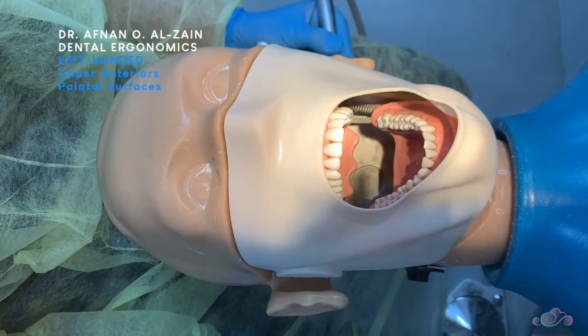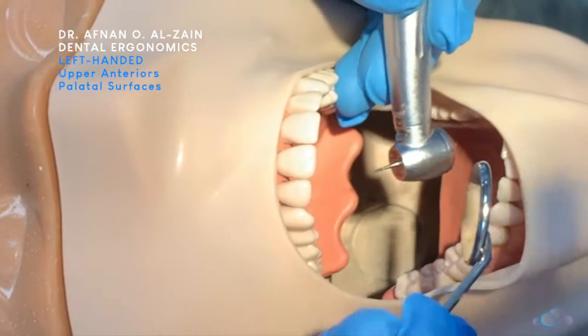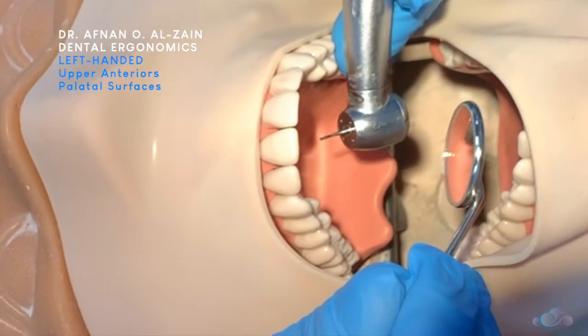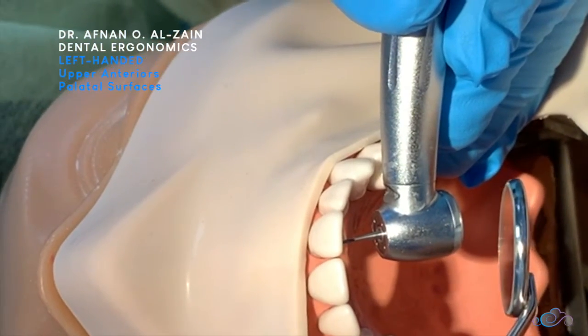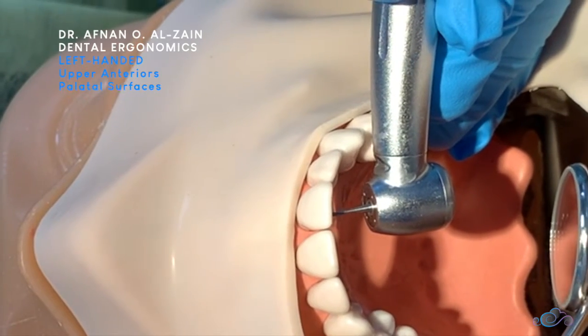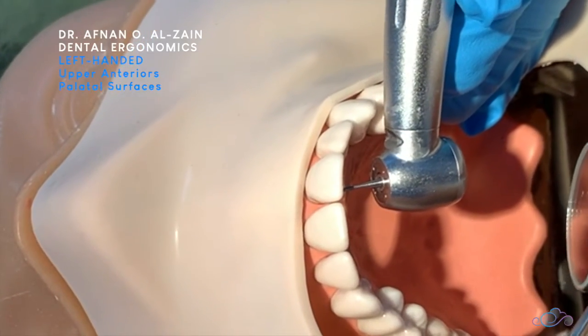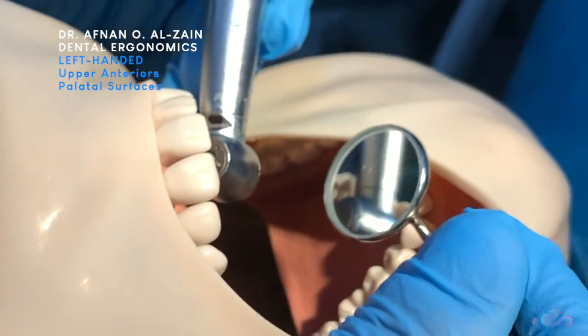When working on the palatal surfaces of the maxillary anterior teeth, you're going to place finger support on the teeth and then place the handpiece perpendicular to the surface. You're going to look through indirect vision by placing the mirror behind the handpiece and then start tilting it until you can see the palatal surface clearly.